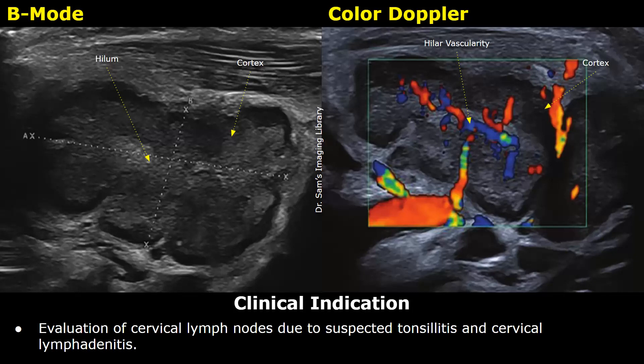This is our first example of a reactive cervical lymph node. In this example, the clinical indication is evaluation of cervical lymph nodes due to suspected tonsillitis and cervical lymphadenitis.